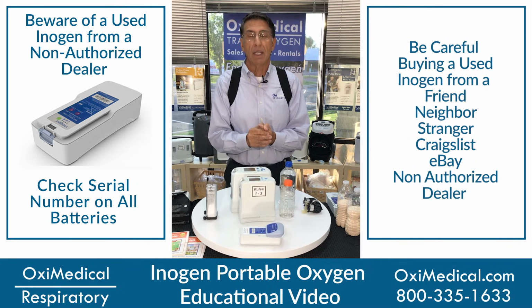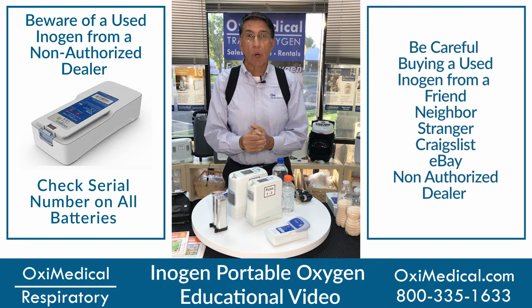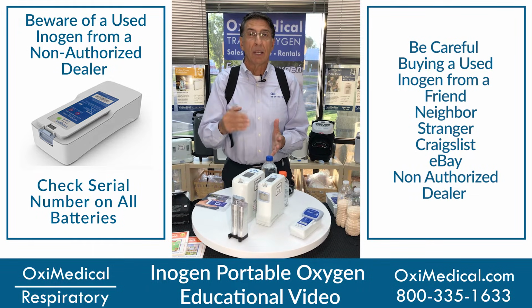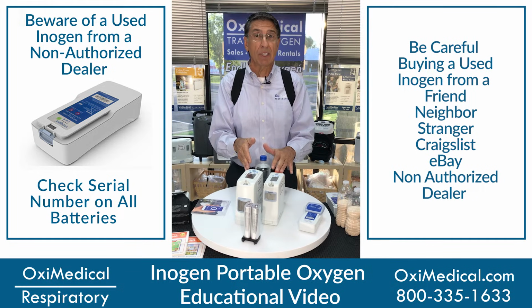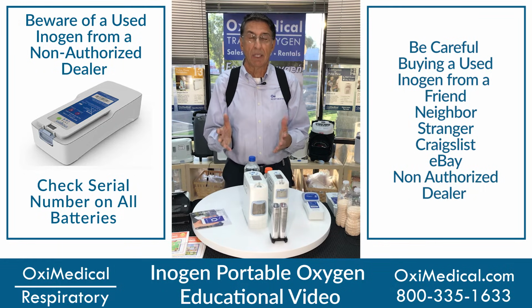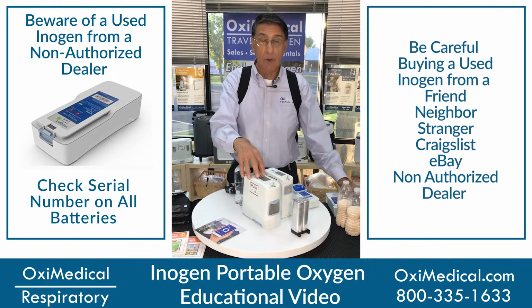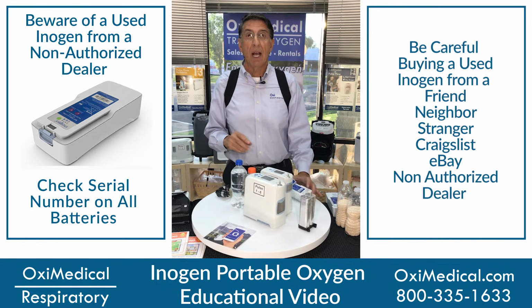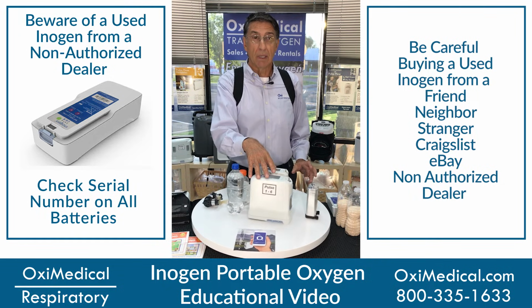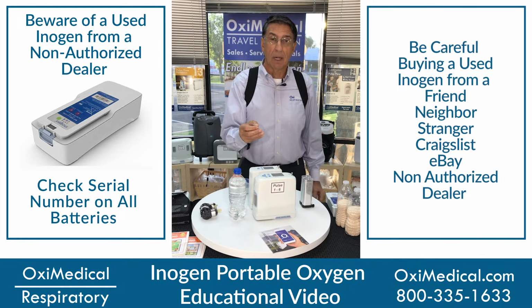Speaking of buying an Inogen from a non-authorized dealer, let's say you get it from a friend. The warranties are not transferable. So if you get a machine from a friend, it's not going to have a warranty. They cost $400 to $600 to fix one of these machines. So be careful of eBay, Craigslist, buying it from a neighbor. They do have an oxygen analyzer built in every machine, but there's no guarantee on the batteries. And there's no guarantee if you drop the machine and something breaks on the interior of the product. You have to be careful on those items every time you buy a used machine.